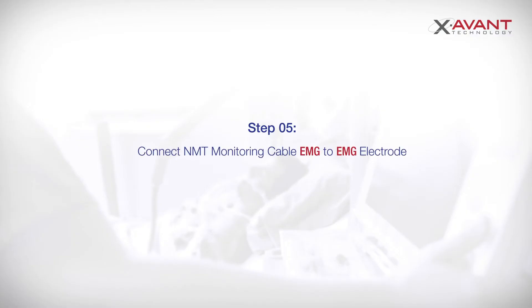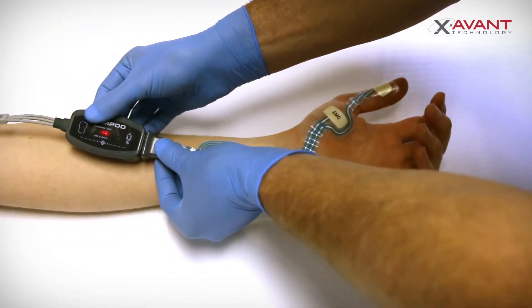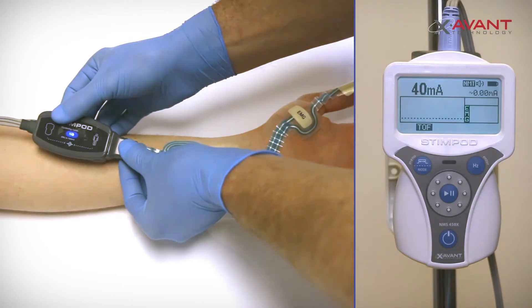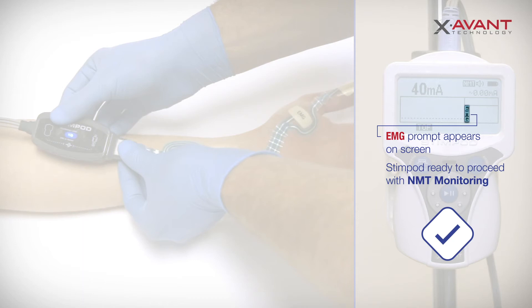Now connect the EMG cable to the electrode. Once connected, the LED color will change from red to blue and the EMG indicator will appear on the StimPod. The StimPod is now ready to proceed with NMT monitoring.